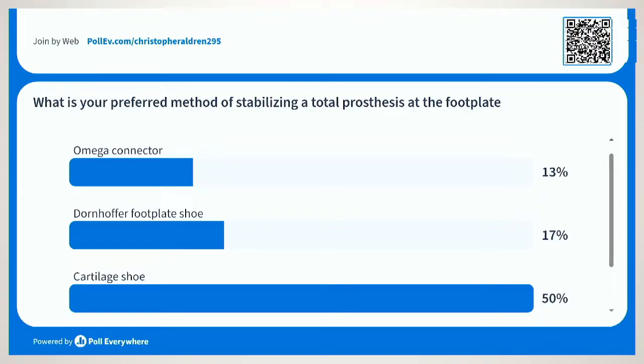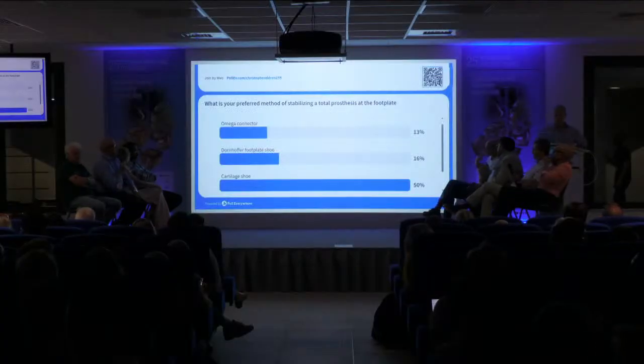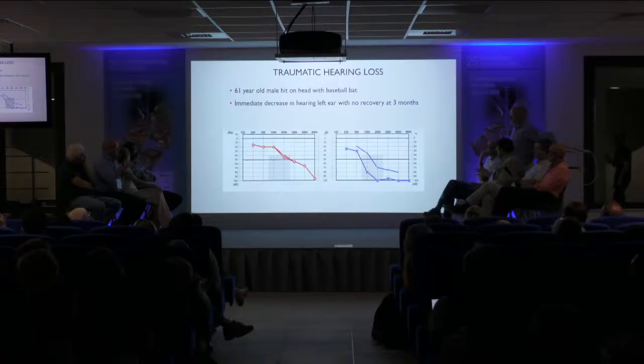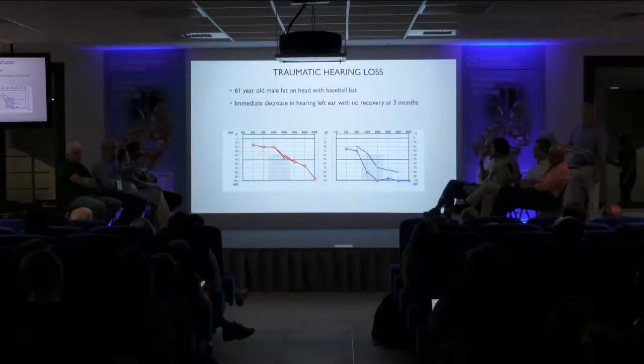So a bit of a spread, but in favour generally of cartilage. And there is this Kurz punch that punches out a little bit of cartilage, but as I said, you need to cut your cartilage thin for that. Chris, you can also use a vein on the intact foot plate. A vein graft is like a carpet in the bathroom. It will prevent the sliding of the shoe of the prosthesis. Well, I've never done that, so that's a good tip. Used a bit of vein. Perichondrium or vein graft on the foot plate. The difference is that the vein is sticky. It will stick.